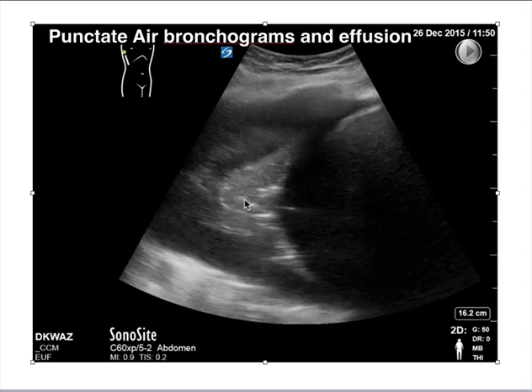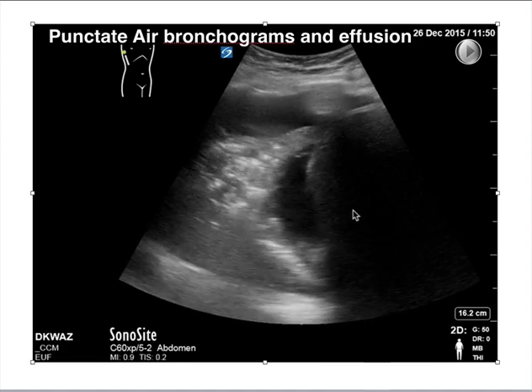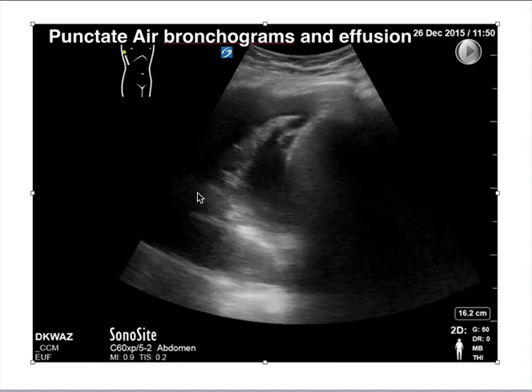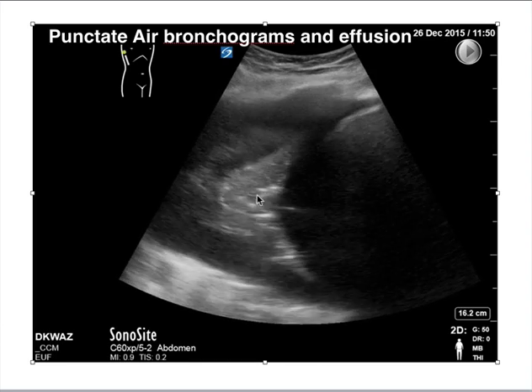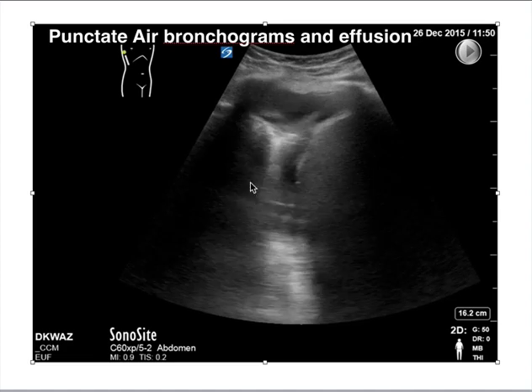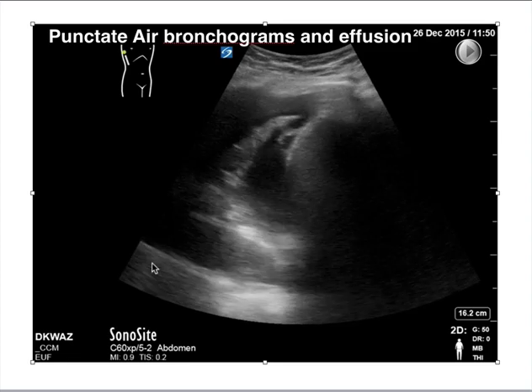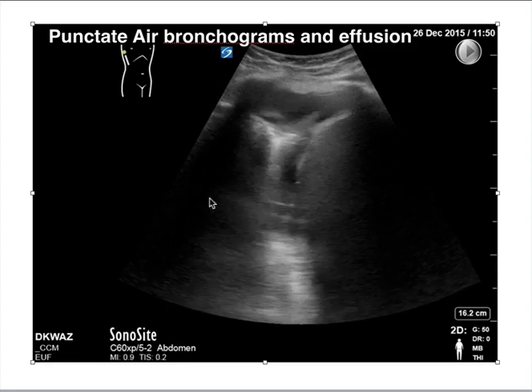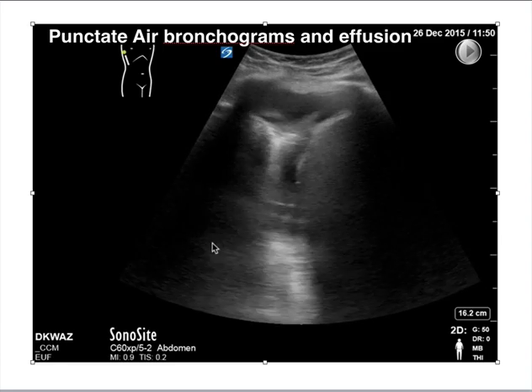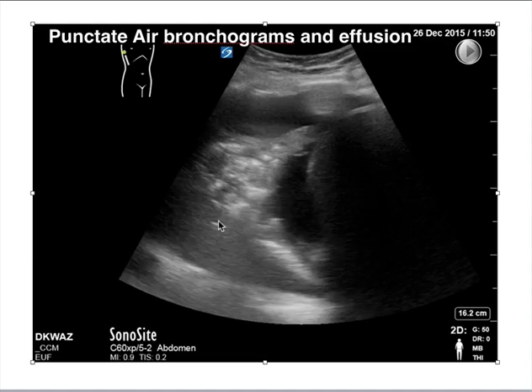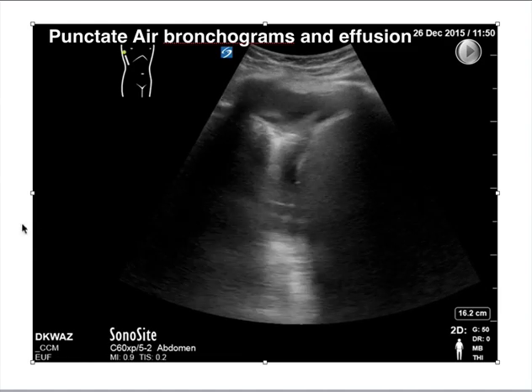Here's another picture of punctate air bronchograms. You have a diaphragm, a liver or spleen — it looks like we're on the liver side — and you can see a pleural effusion. If you look at the lung, you can see all these white air bronchograms, most of them punctate. We don't see dynamic air bronchograms moving with the ventilator, but if this patient had an increased white blood cell count and fever or you were concerned about pneumonia, this may be a developing pneumonia and you may want to either drain for a sample or start antibiotics.